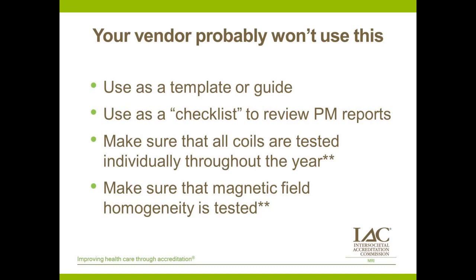There's a lot of infrastructure there. So their engineers already have a system and a workflow within which they have to work. If you give them a form like this and say, I need you to fill this out instead of printing me the standard report from your company, that's probably not going to be viable for them, and they will probably politely decline to fulfill that request. You will also probably not be able to negotiate this into your service contract in the future, although I wouldn't discourage you from trying. Anything's fair game when you're negotiating a contract.